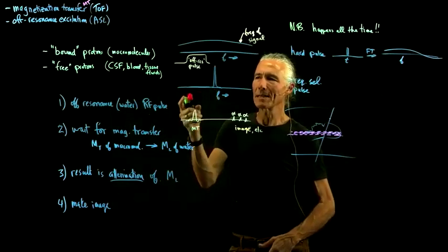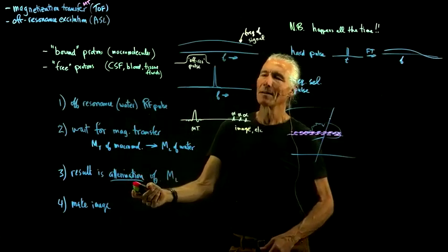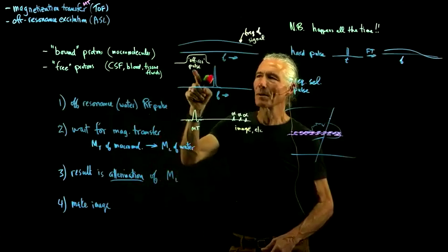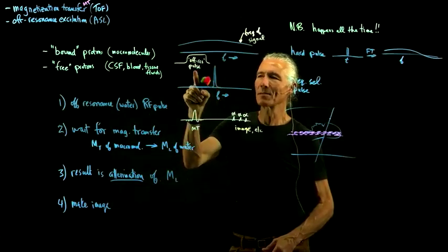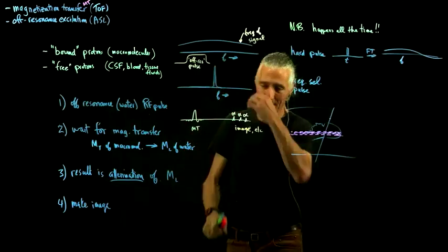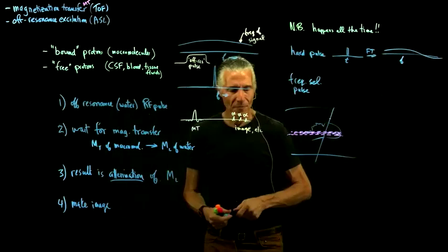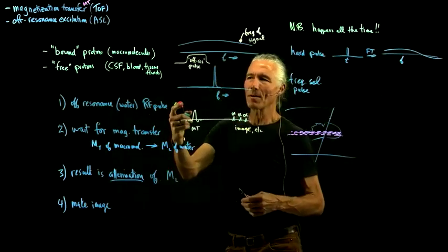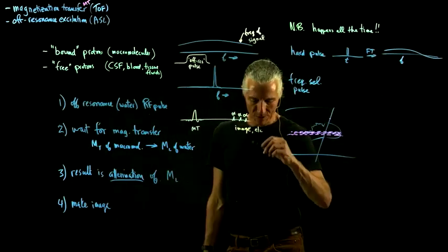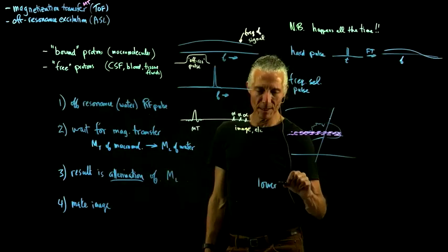It's partly because you don't get that much attenuation when you do the pulse, and you can't do a perfect pulse, and you hit some of the signal that you're trying to actually record. So there's several reasons. And you've got to wait around more. There's more time to wait around. So one of the things is it generally will have a lower signal to noise.